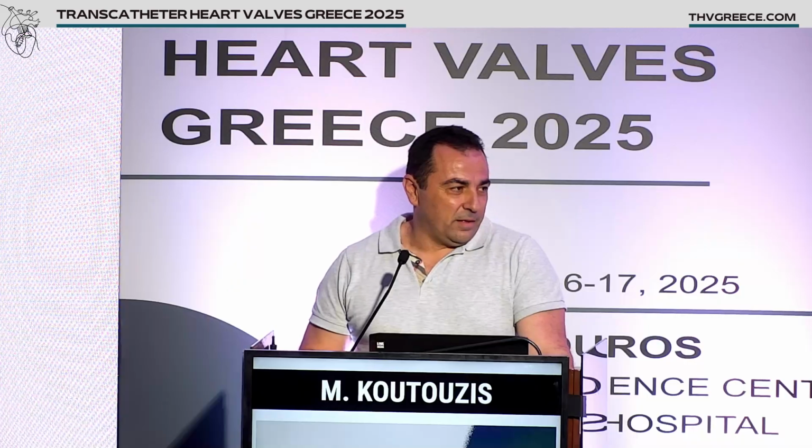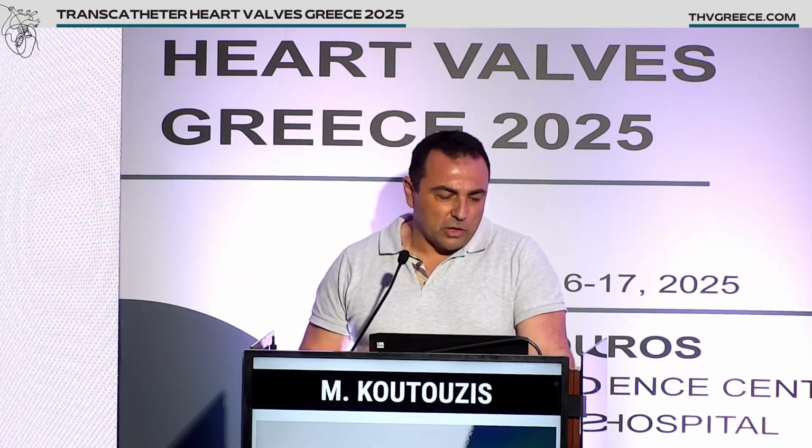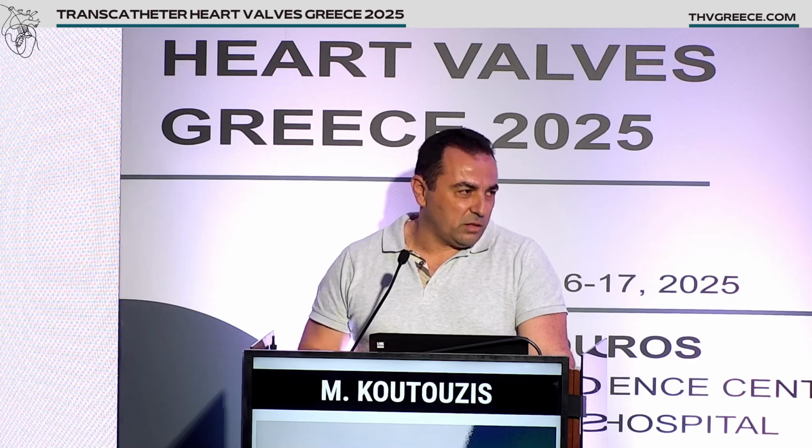Thanks for the invitation. Great case. In your opinion, how did you choose this approach instead of surgery, for example? Instead of? Surgery or another? Surgery is not an option. Okay. So a 77-year-old patient, obese, with claudication, it was not in our option. The only question was how would we do it with TAVI.